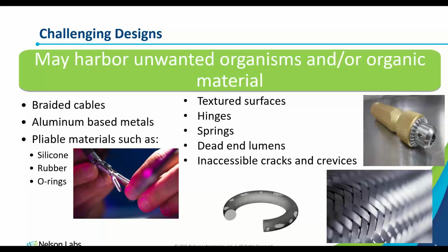Great, here's our next one. What is the requirement you generally advise targeting for the dryness of a device after cleaning and before it goes into steam autoclave?